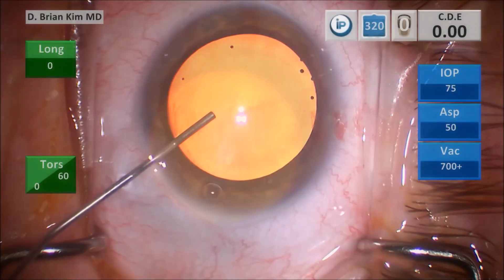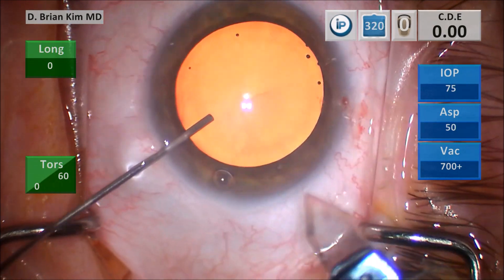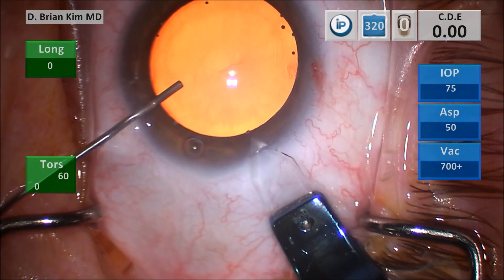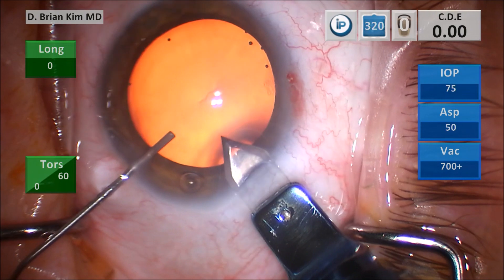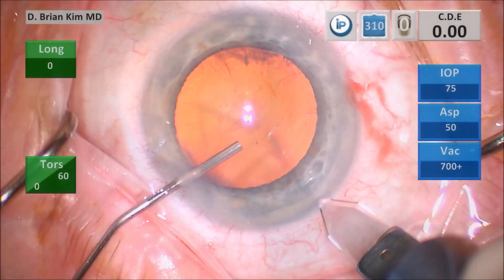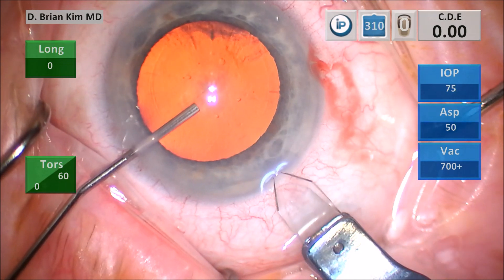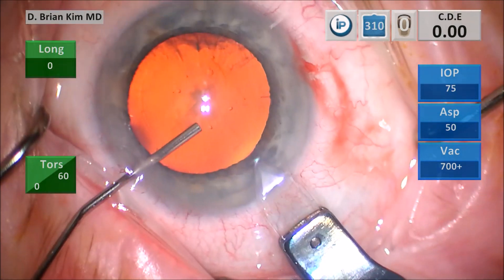Filling the eye with viscoelastic again, keeping that cannula tip toward the incision, making my groove, finding the deepest part of the incision, tunneling the cornea, repositioning, and then puncturing. Again: vertical incision, find the deepest part, perform your corneal tunnel, and once you reach where you want to go, tilt and then puncture through.